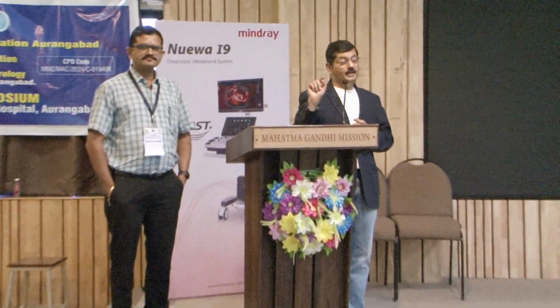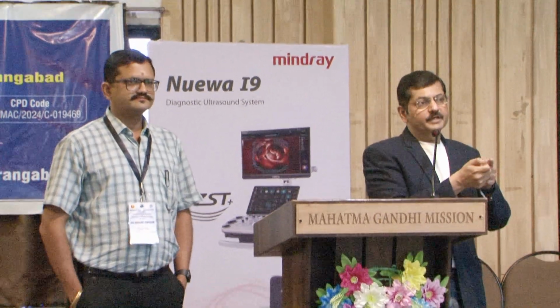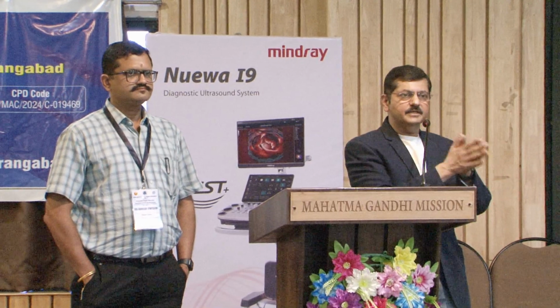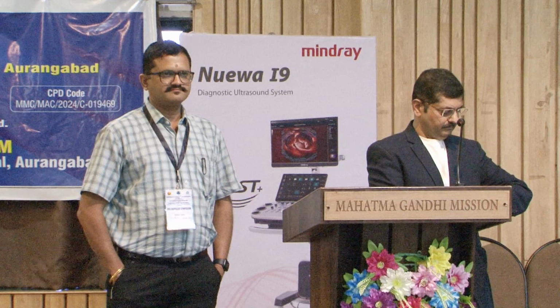Abhay sir, one last question. During the procedure, how do you confirm that you hit the prostate? After taking the specimen, what are the things you look for that the tissue is of prostate and not anything else? Yeah, because your needle under vision is going into the prostate, so whatever is coming out should be from the prostate. One of the points I had mentioned is to check all the cores. As soon as you remove it, you check whether the core has been obtained. If it is not from the prostate and it is just rectal mucosa, it will be very thin and flimsy. If you are suspicious, you can target again and take one more biopsy. So first, you do it under vision, and second, the tissue you see. Every core you have to check. It is heavier than the other tissue.